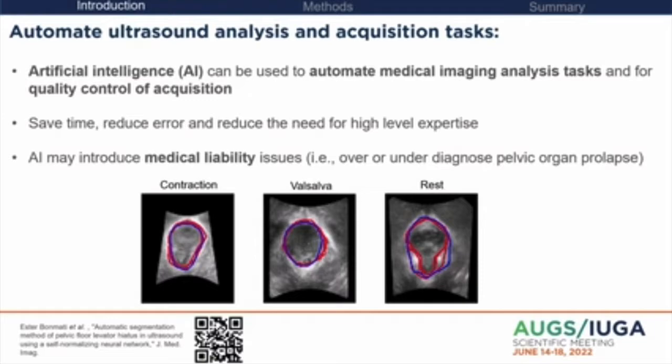An example of the first convolutional neural network architecture used in the pelvic floor domain is shown here from Esther Bonmati. It segments the levator hiatus automatically from a plane of minimal dimensions. The blue is the algorithm and the red is the user's segmentation — you can see visually they're quite similar.